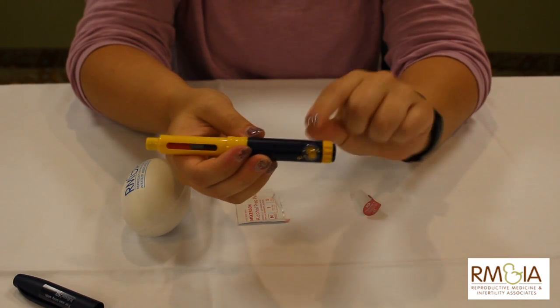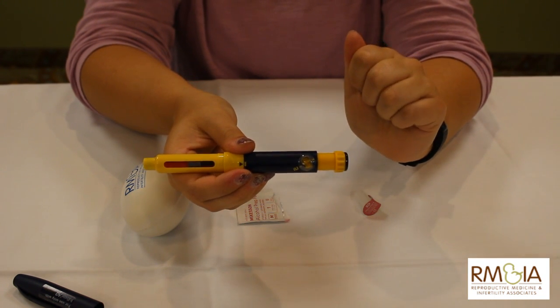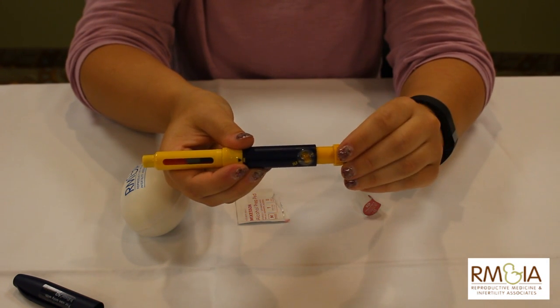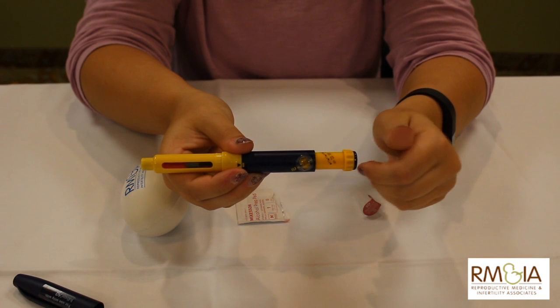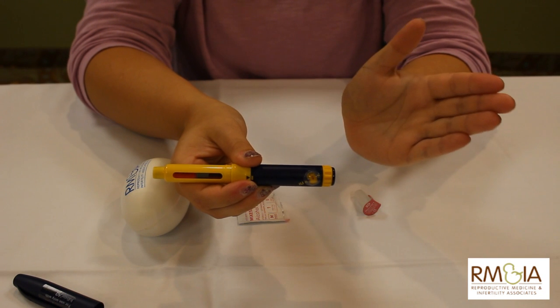Now you're going to look through the view and dial up to the amount of medication we tell you to. If you accidentally dial too far, the pen does not let you reverse, so we're going to go out the entire way and start over.